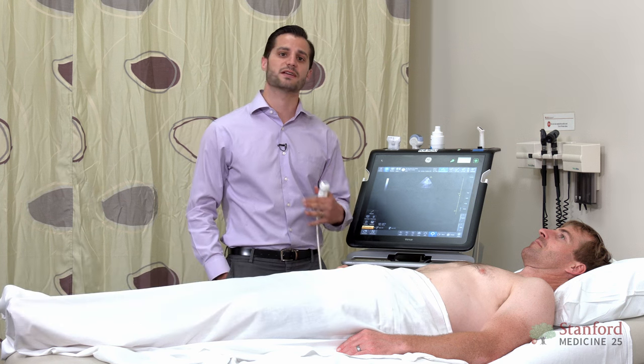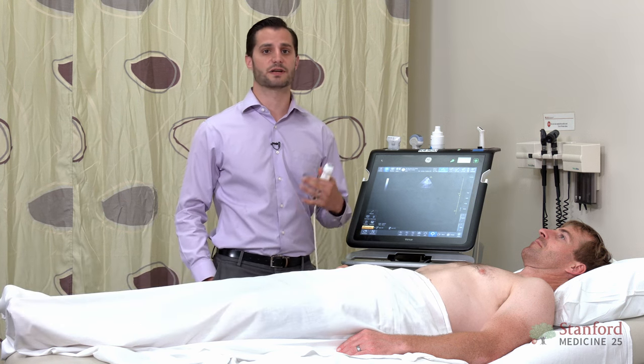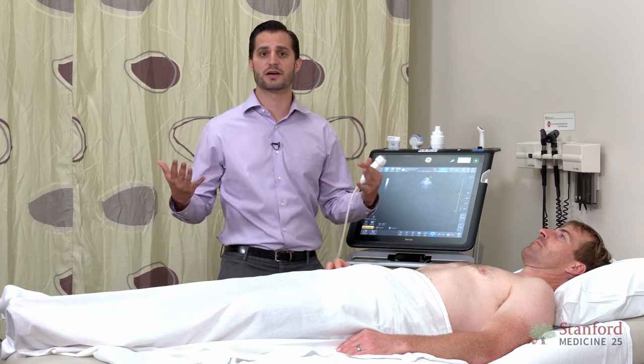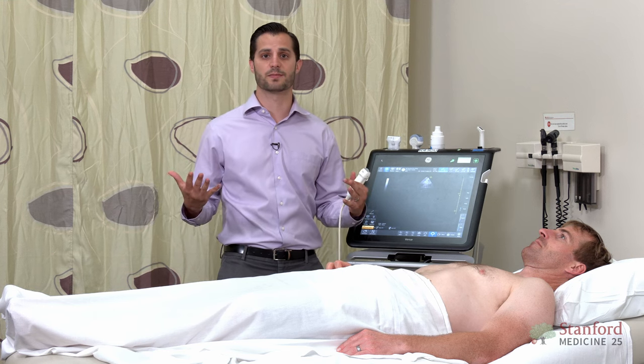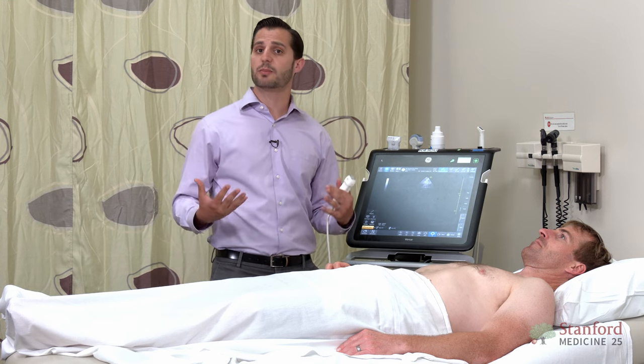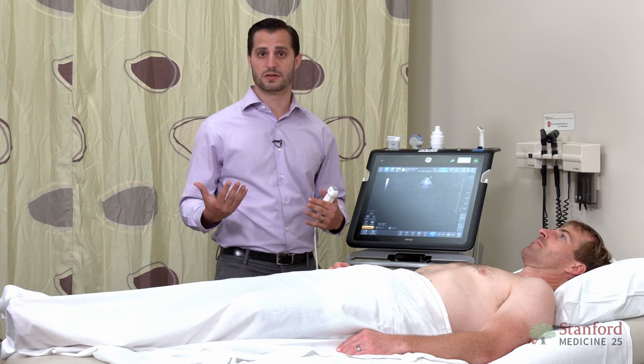Something to keep in mind with Cardiac POCUS: it can be really challenging, and it can take a lot of time to master. It's totally okay if you're not able to visualize all the windows you want for any given patient. Some patients, for whatever reason, just don't have that window. That being said, there are a couple of troubleshooting tips we can give you for each of the views.